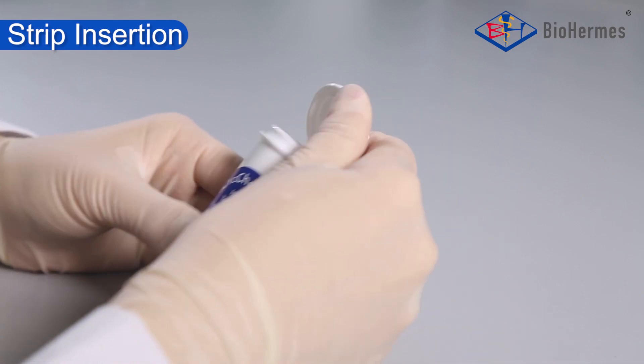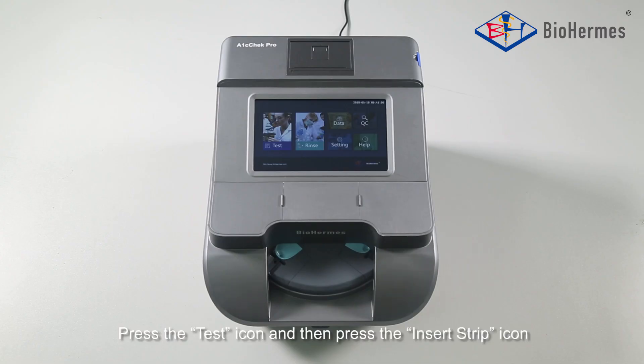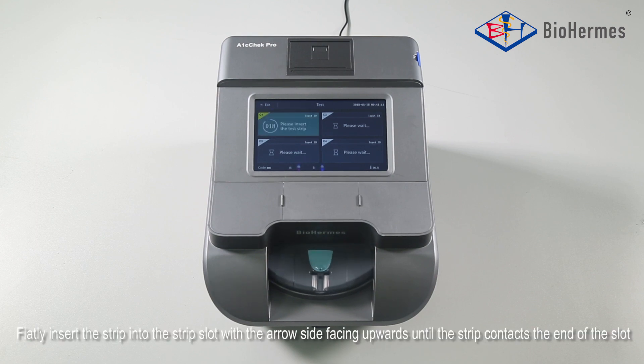Strip Insertion: Take out a test strip and close the vial immediately. Press the test icon and then press the insert strip icon. Flatly insert the strip into the strip slot with the arrow side facing upwards until the strip contacts the end of the slot.